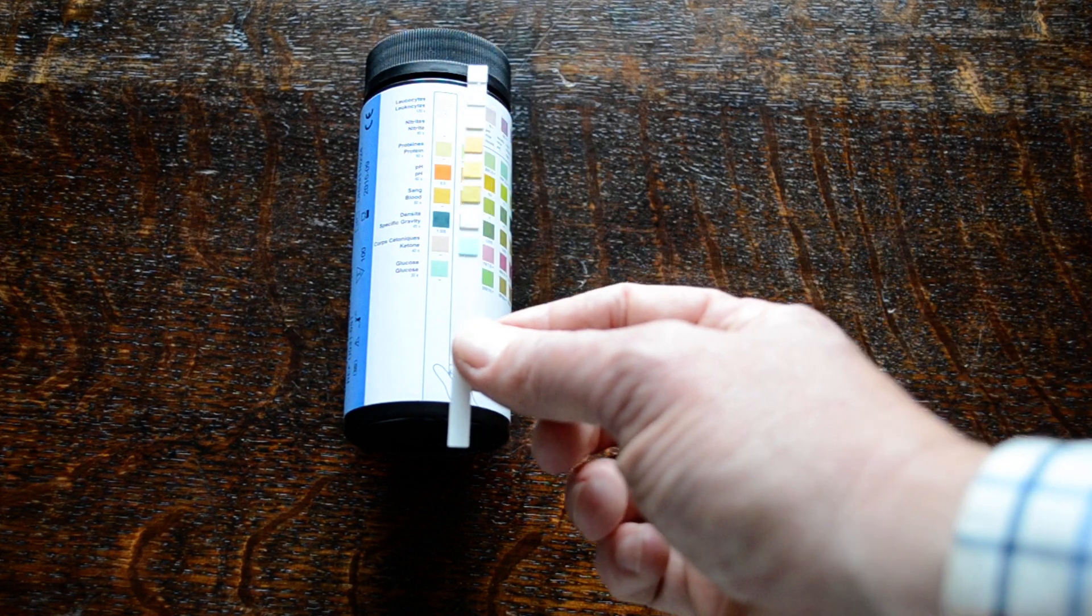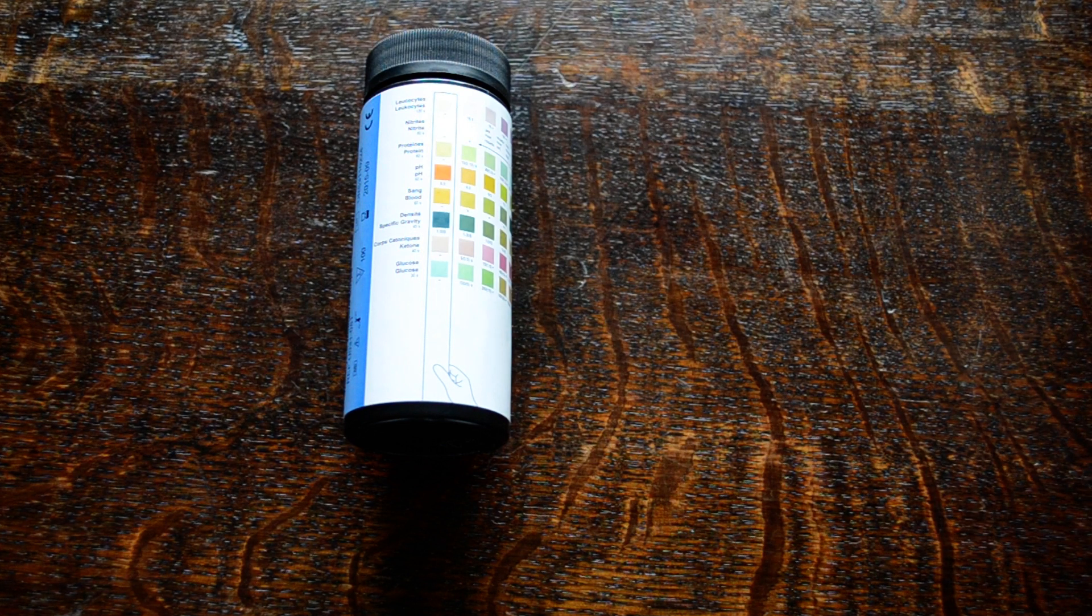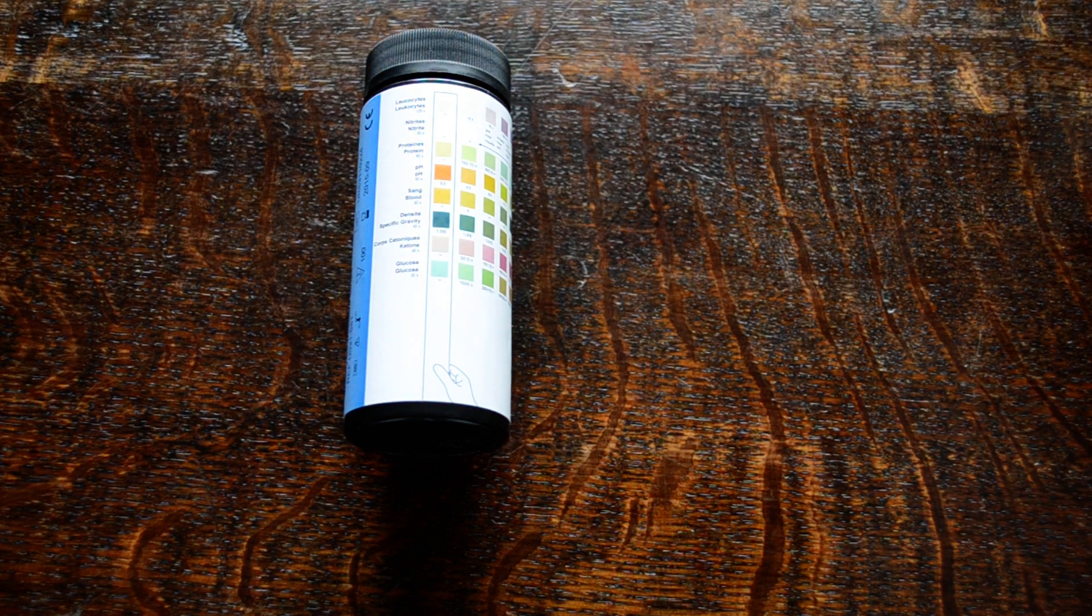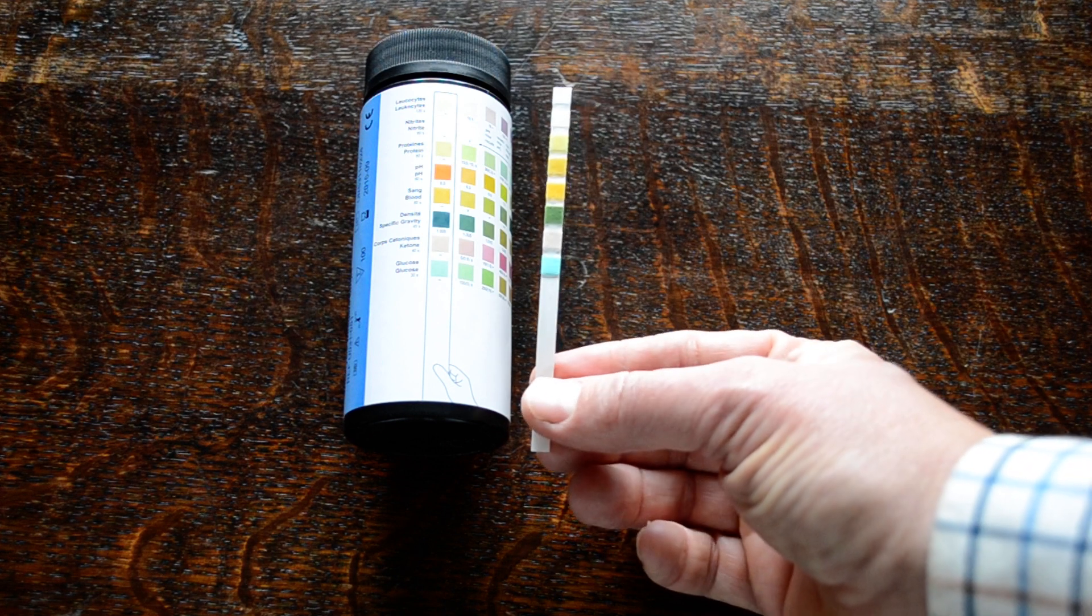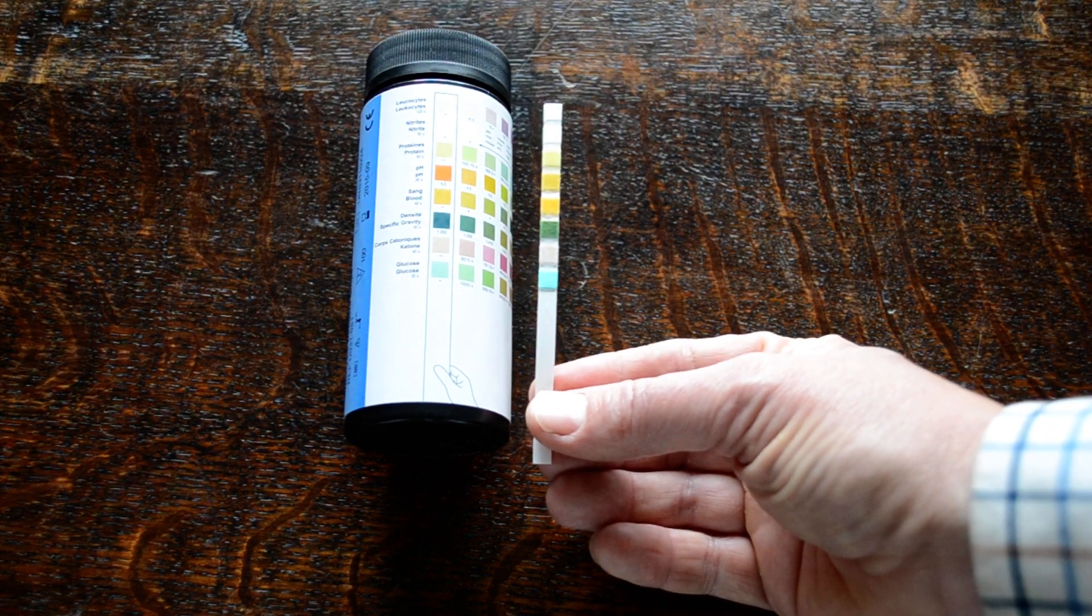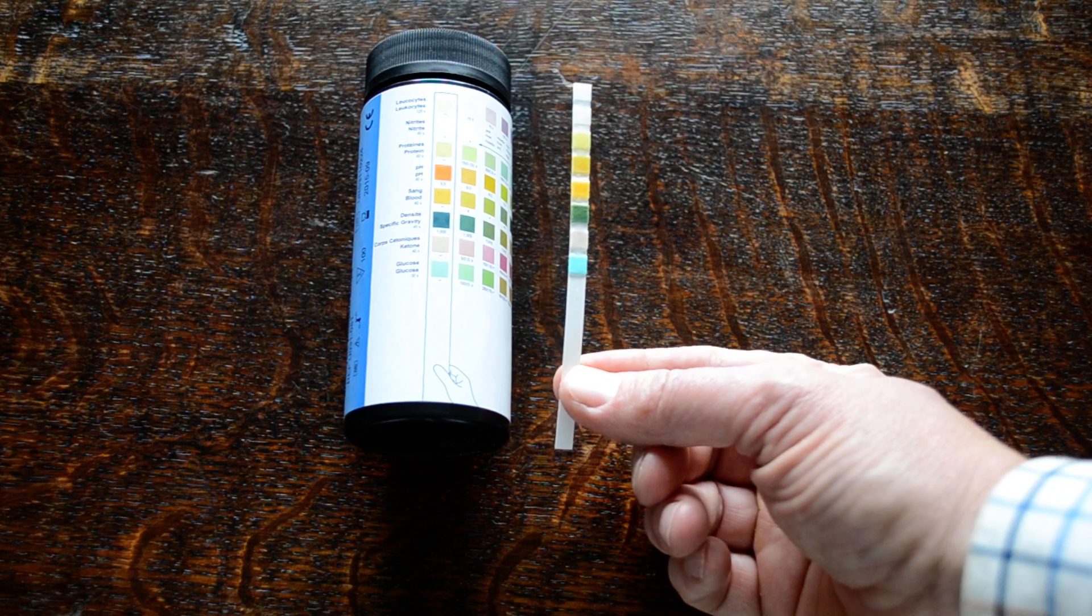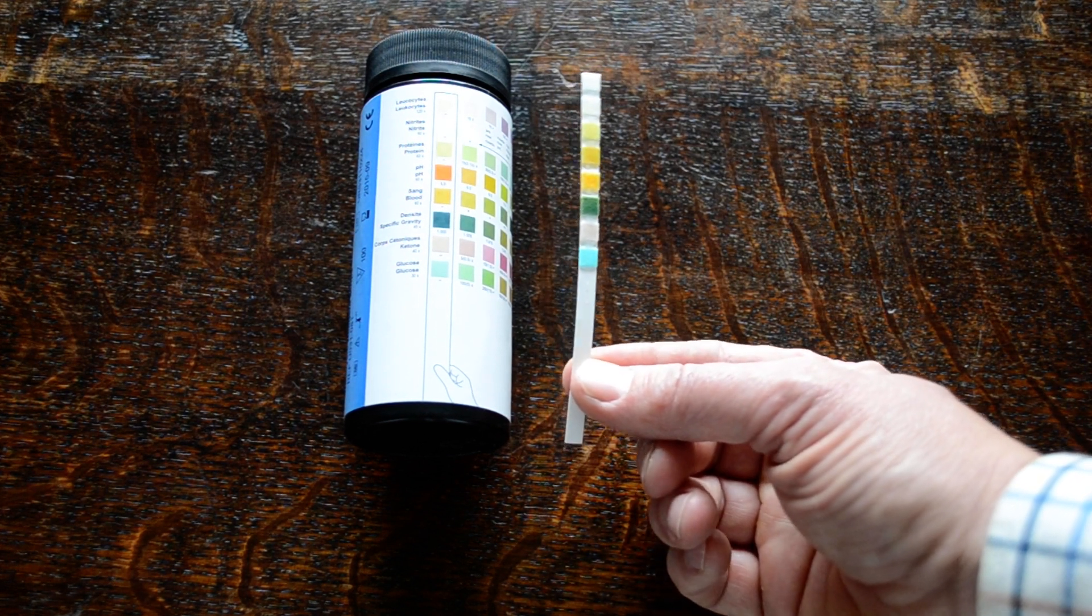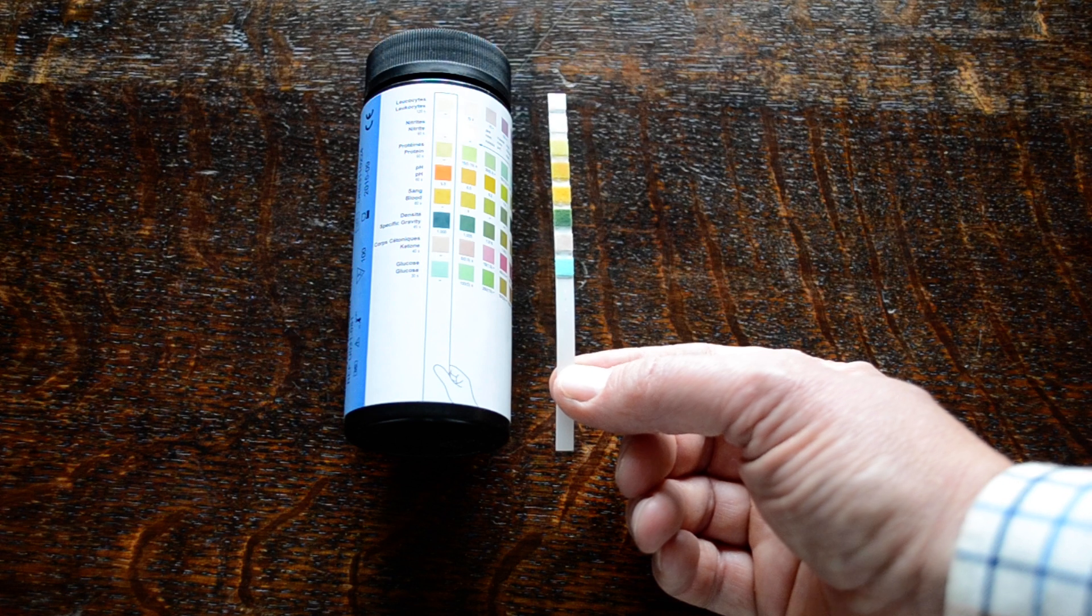I'm going to take that off camera now, dip it into a sample. And no, it doesn't have to be a really deep sample container that you dip these into. This test strip is lovely and flexible, so they can be bent round and just dipped so all the pads are dipped under the urine sample and then removed.